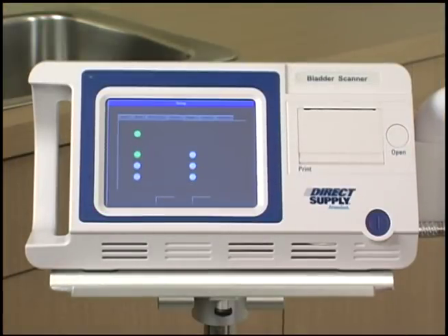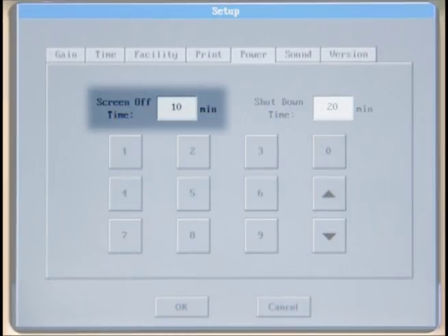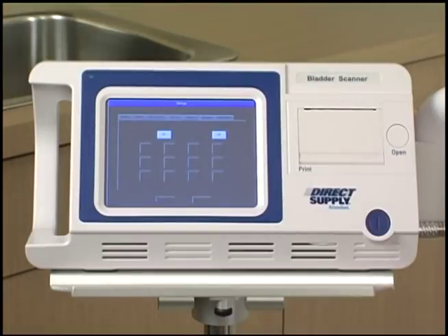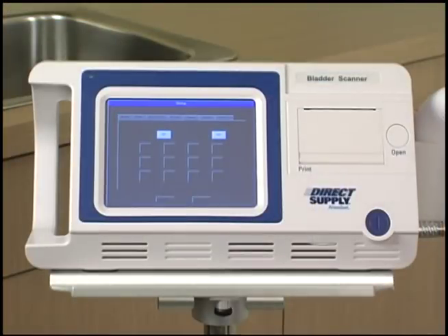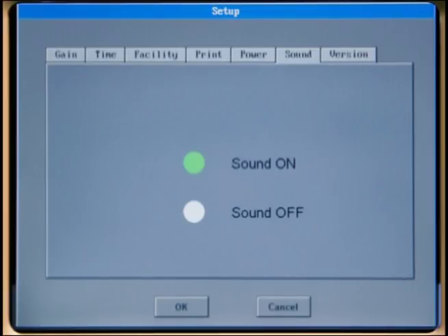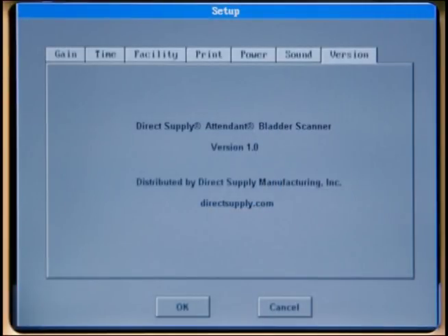Selected images are indicated by a green button. Select the power menu to set the screen off time and shutdown time. The screen off time sets the number of minutes the display will stay powered when the device is not in use. If the device is not operated within the time period set for screen off time, the display will shut down to conserve battery life. The shutdown time determines how long the device will stay powered when not in use — if not operated within the designated shutdown time, it will turn off. The sound menu allows you to turn the unit's sound on and off. The version menu displays what software operates your bladder scanner; this is purely informational and cannot be adjusted.